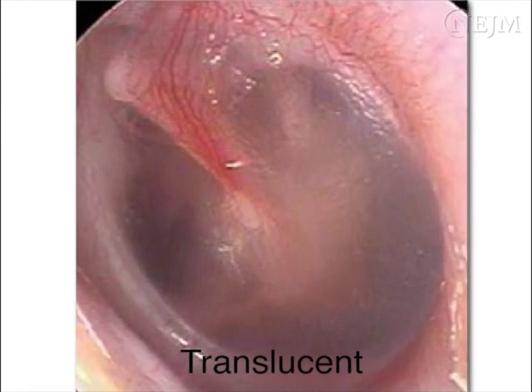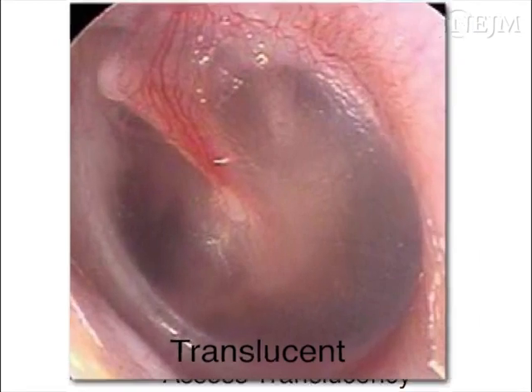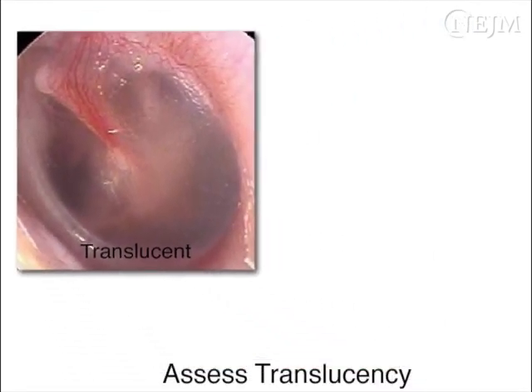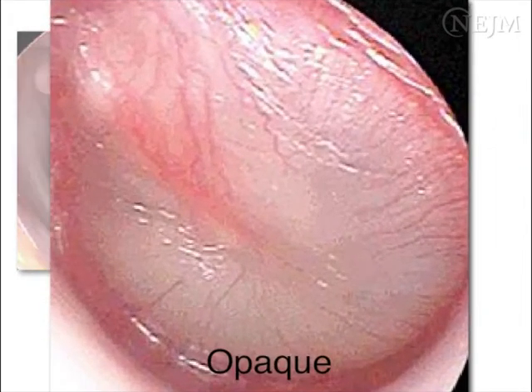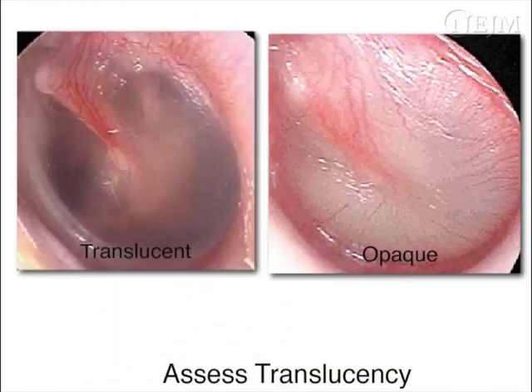Next, assess the translucency of the tympanic membrane. A translucent tympanic membrane has a ground glass appearance and allows visualization of the underlying middle ear structures. When middle ear effusion is present, the tympanic membrane appears opaque and visualization of middle ear landmarks is impaired.